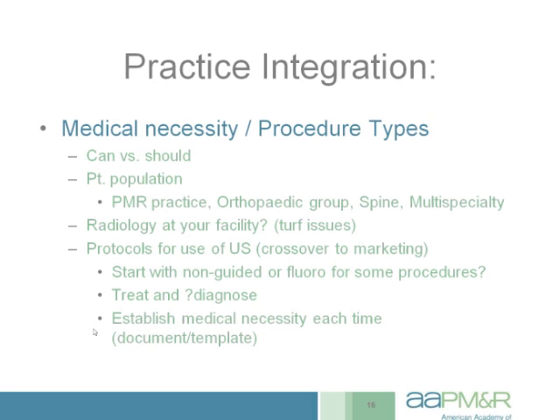And I think it's important when you're using musculoskeletal ultrasound to be doing it responsibly and establish appropriate medical necessity each time. And I actually have that built right into my procedure template. For those of you who attend the course, I'll be providing some sample templates you can use, if you're not already doing that in your practice, that will make establishing medical necessity fairly straightforward.